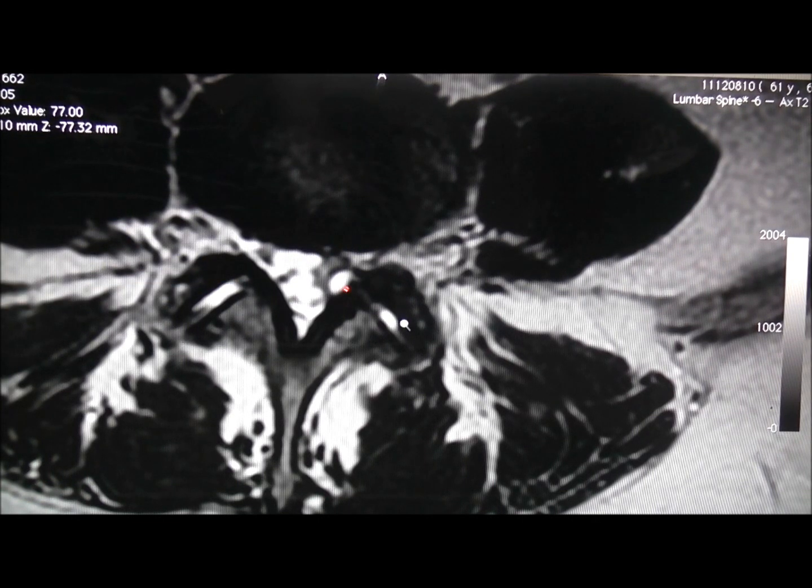So again, this is a clear indication why it's very important to get an MRI scan, because many therapists would maybe say there's no need because you find lots of incidental findings in scans that don't necessarily cause the patient pain. But you can clearly see clinically... Which is true, but like you say, you have to put it into clinical context, don't you?